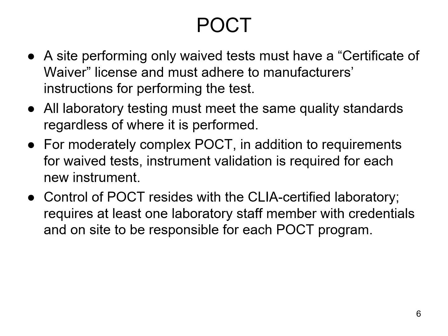And then they also have to make sure that they are performing the test just as the manufacturer states. And so all laboratory testing must meet the same quality standards regardless of where it's performed. So if it's done in the lab or if it's done at bedside, those things still have to be met as far as those quality standards and meeting the requirements of those procedures that the manufacturer states.